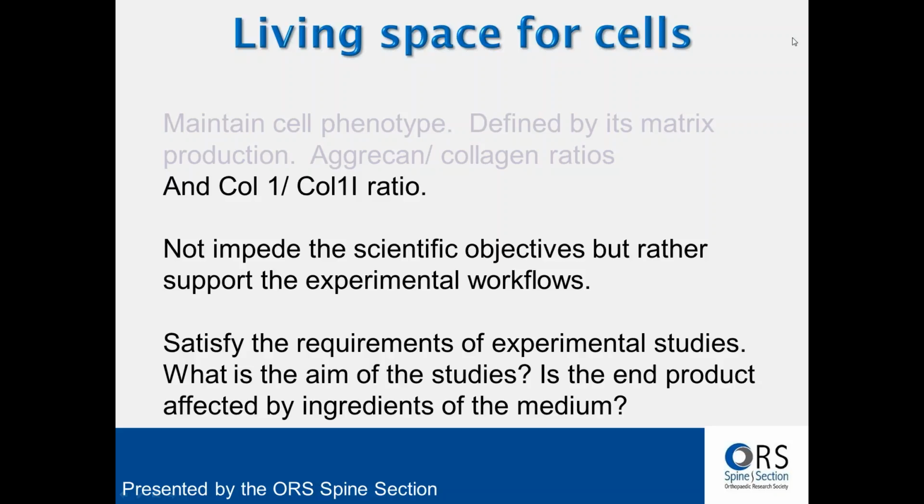It's very interesting to see when you're reviewing papers and you see that people you are comparing have used all sorts of different types of media with all sorts of different glucose concentrations, and the ingredients are very different, and then you get different results, and people are wondering why they have different results.